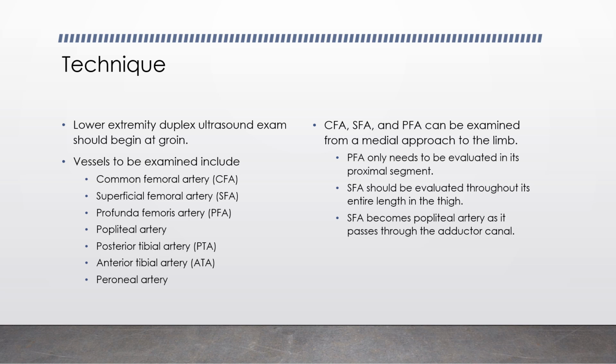We're going to see a very short bit of the common femoral before it bifurcates into the superficial femoral and the profunda. The profunda is going to dive deep, so again makes it very difficult to be able to evaluate. So then we're going to evaluate our superficial and our profunda and our common femoral all in this area. B mode, transverse, long, color Doppler in all three, and then spectral Doppler in all three.